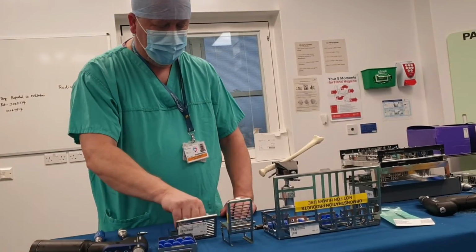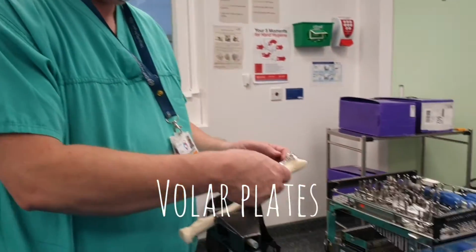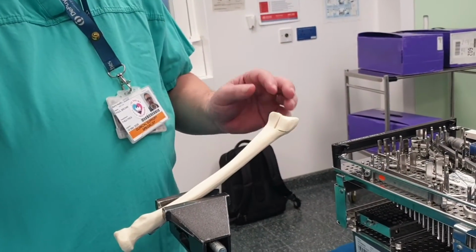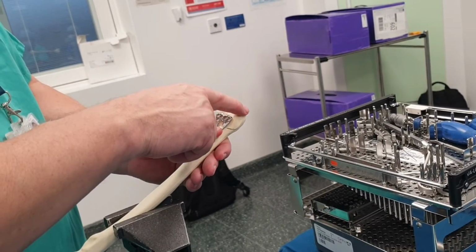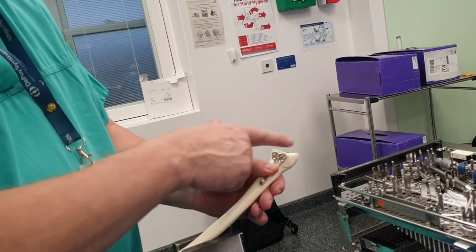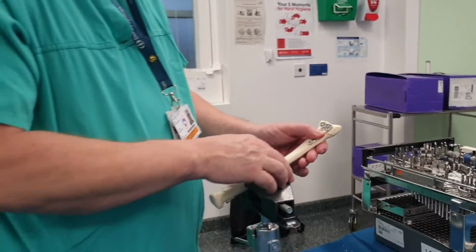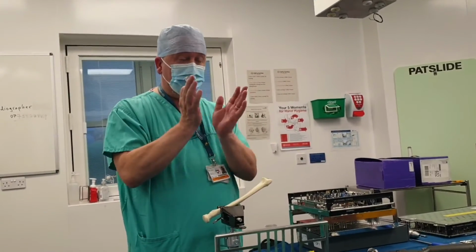We have things like a volar rim plate, so this one will sit past the watershed line and you'll be able to do really distal fractures. With the VA, if you get it to sit right, it will even be able to fire into the radial styloid. So you don't need a radial styloid plate, and with the 30-degree cone, you can fire a screw in there and you can hold that if there's a fracture. And this is what's good about this particular plate and having VA in it.